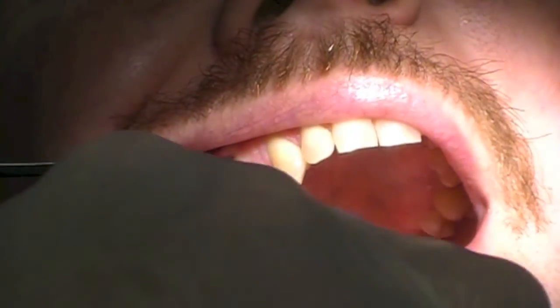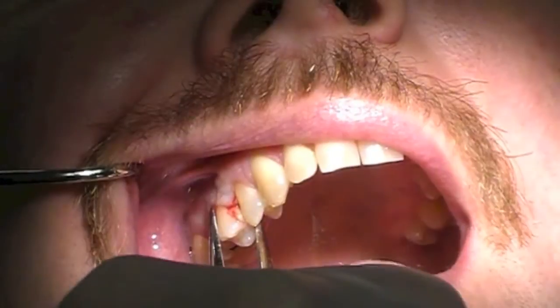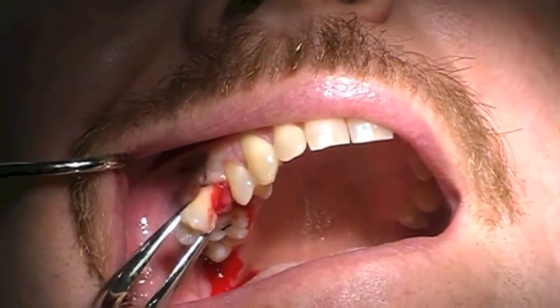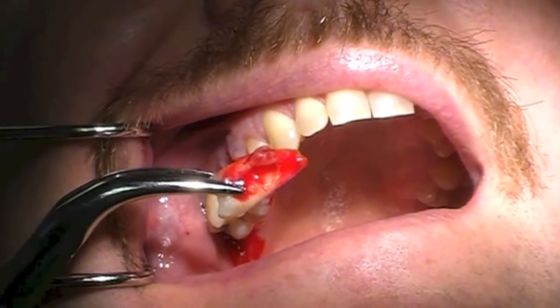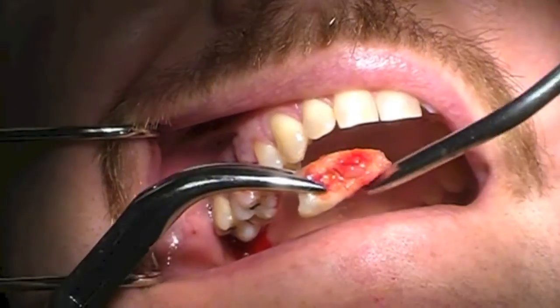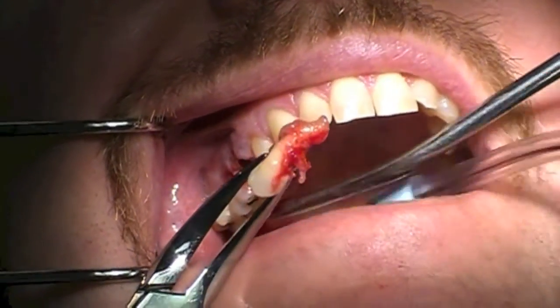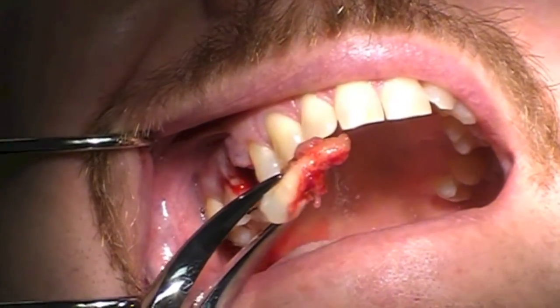And I'm just going to take another forceps and simply remove the tooth and the infection. Go ahead, if you can rinse the section. And you can see the infection, you can see the fracture, and we got the root out in one piece. Amazing. Magical.